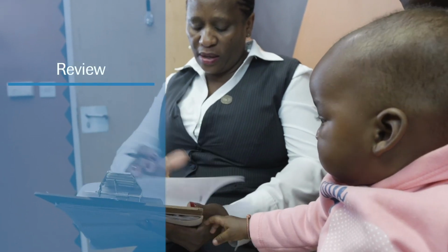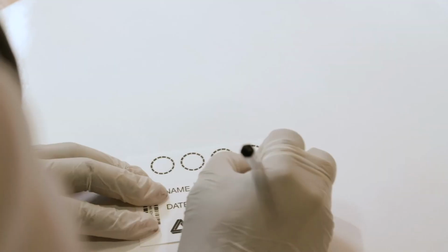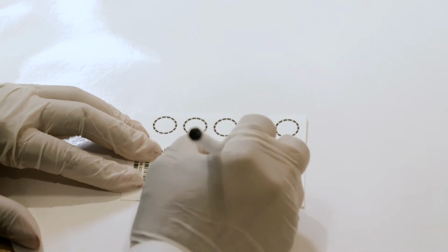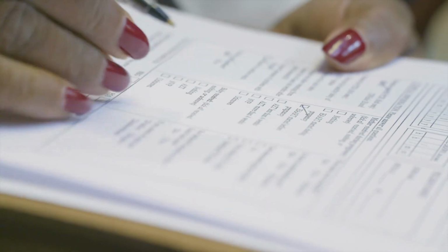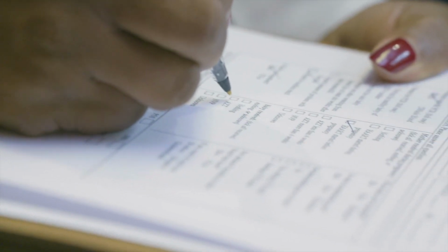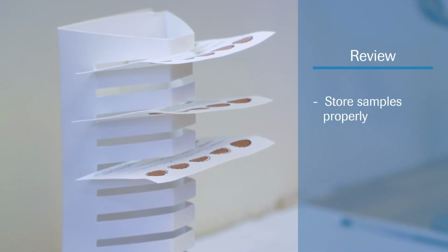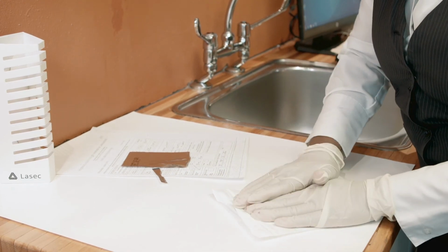First, keep accurate records. The most common reason the lab will reject a DBS is labeling errors. The lab cannot test a specimen if there are errors in labeling. Be sure that all DBS cards are labeled correctly, that laboratory requisition forms are complete and correct, and that specimen logs are kept accurately. Make sure that your handwriting is clear and easy to read. Additionally, it is important that you handle and dry the fresh samples correctly. In this video, you've seen how to collect a quality DBS that can be used for viral load monitoring as it becomes available in your country.